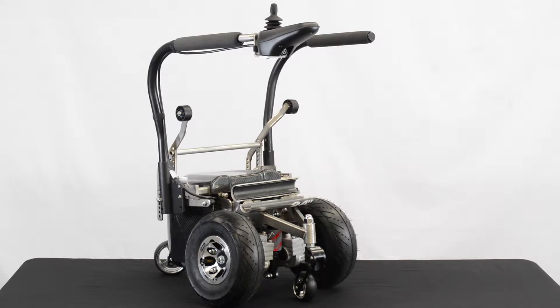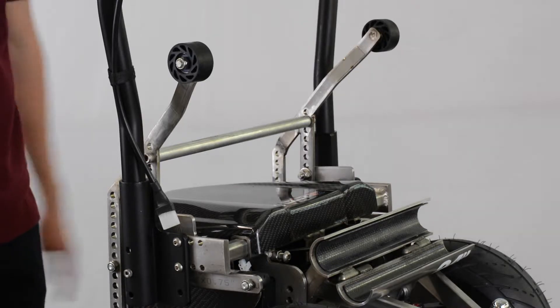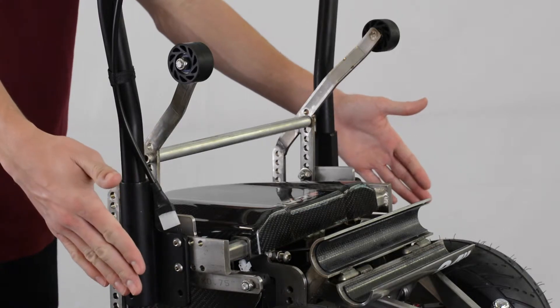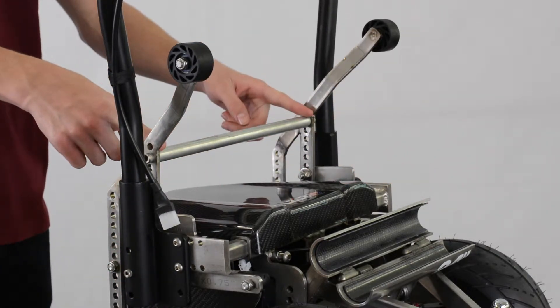The ZX-1 can also accommodate users with seat widths from 14 to 20 inches wide. This ZX-1 is currently in the 16 inch seat width configuration, which can easily be adjusted by moving out the main anti-tilt brackets from the frame housing and then adding the respective spacer bar that corresponds to the new seat width of the user.